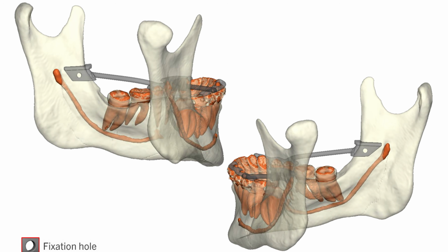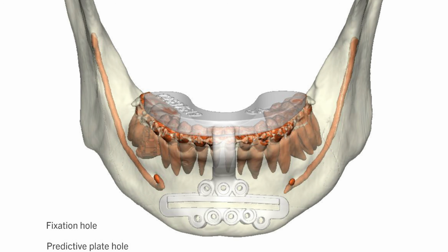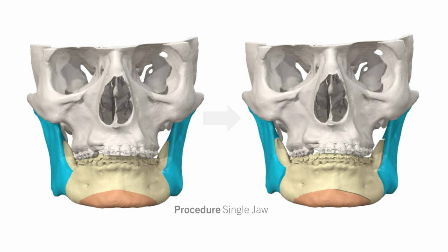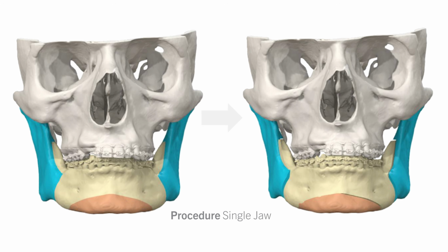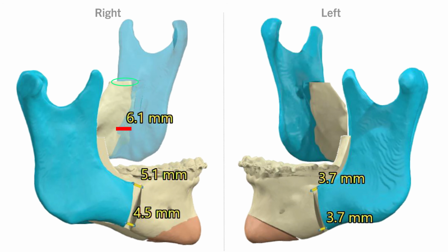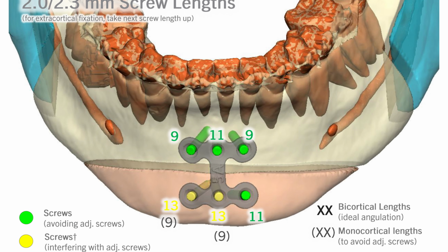digital scan of his dentition. All of this anatomic data is uploaded to a medical modeling company, and then I perform an online virtual surgery. The virtual surgery is invaluable because it allows me to determine down to 1/10 of a millimeter where the optimal jaw position is for this patient.